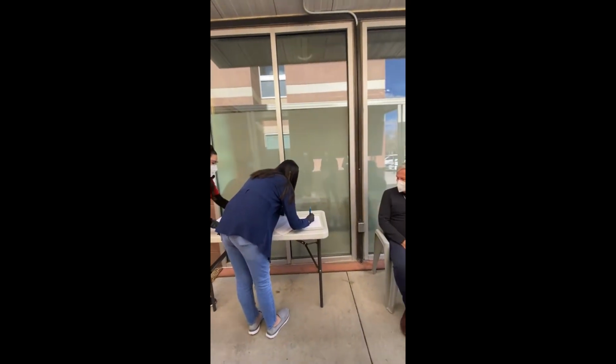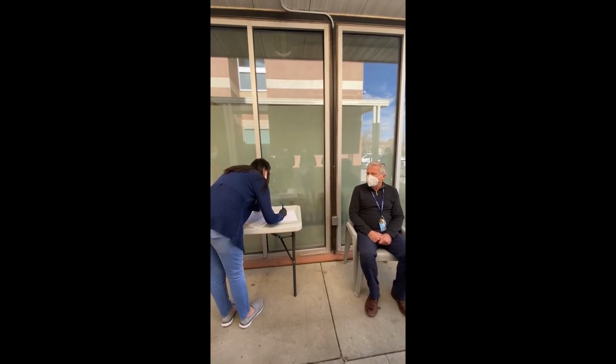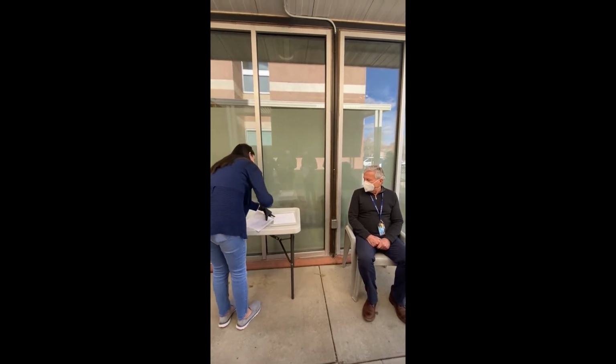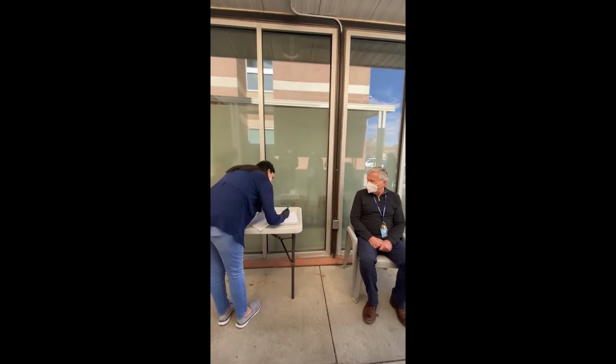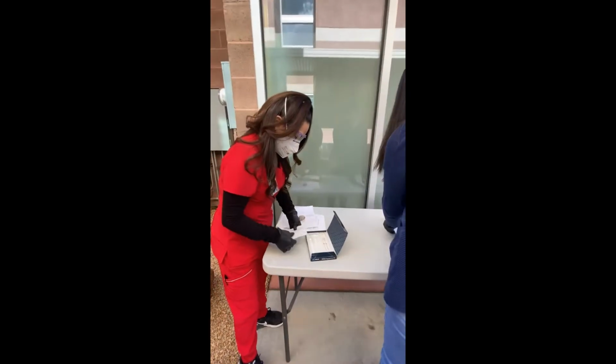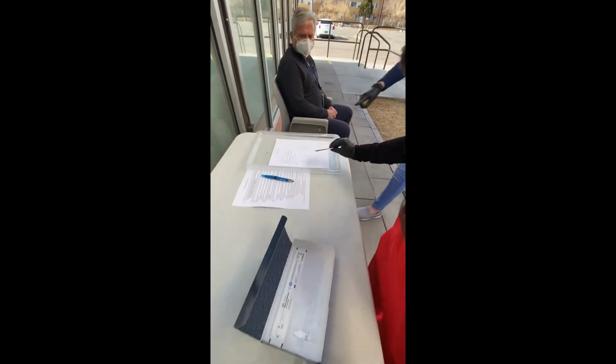As you can see, Jessica is filling out the form on the tray, and that form will stay on the tray as the test itself will be laid on top of the form to confirm the name. The Mo2 staff member will begin to prep the COVID-19 test. To prep that test, the Mo2 staff member will open the package with the test itself and lay it flat with the pink side down on the test paper.